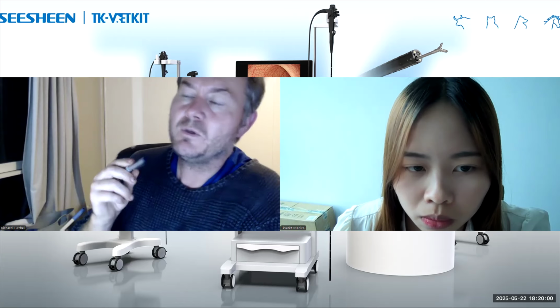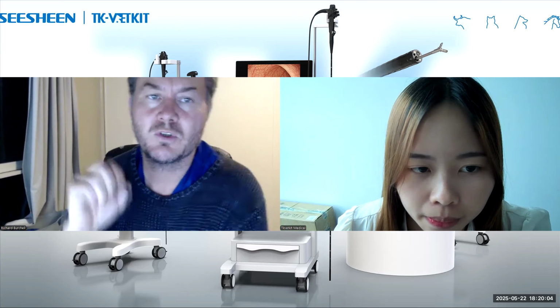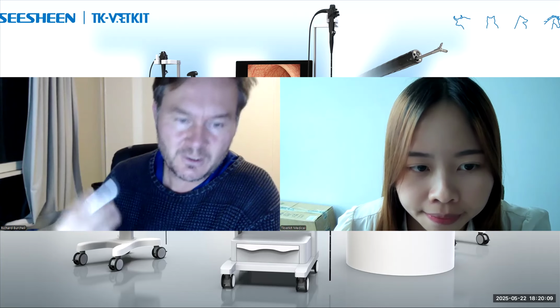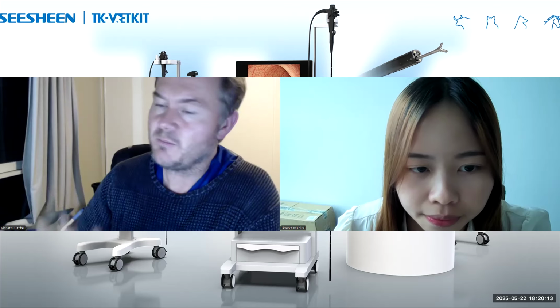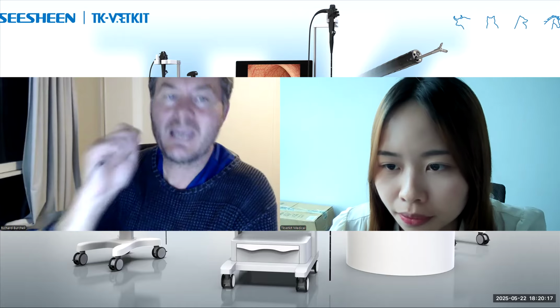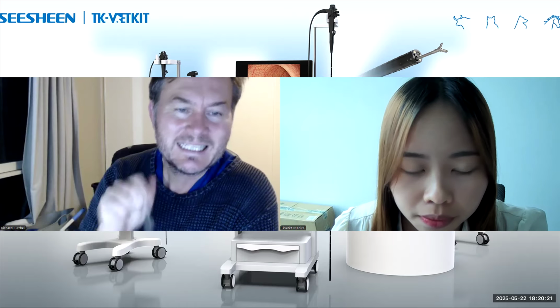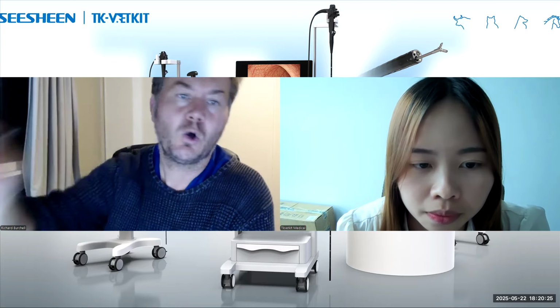So what I'd say is if you're learning and you don't want to be under pressure, where you feel like you need to do it quickly, then scope the lower airways, have a good look at them, do a thorough job through the ET tube. But then when you extubate, have a look at the airway that was underneath the ET tube so that you've at least had a look at the whole airway.